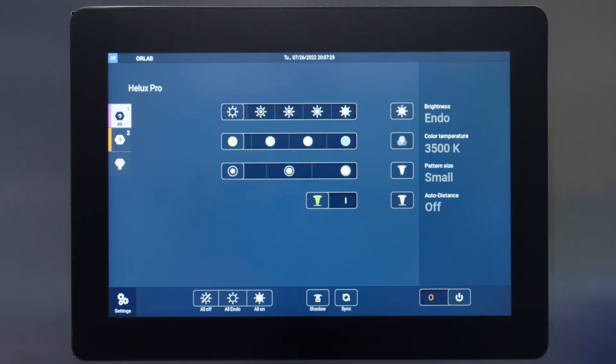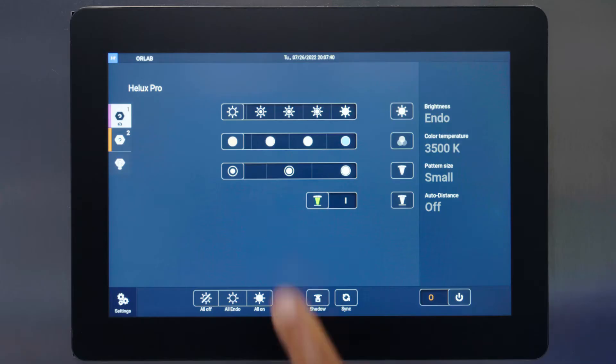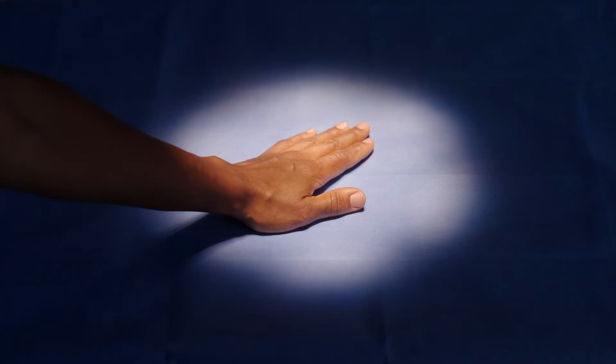The light features four color temperature settings that can be adjusted based on surgical procedure or surgeon preference. The settings are 3500K, 4000K, 4500K, and 5000K.